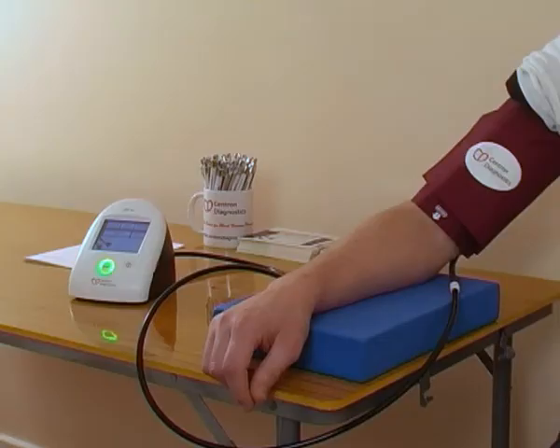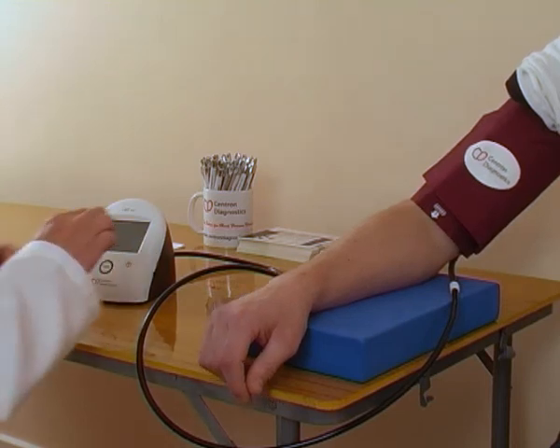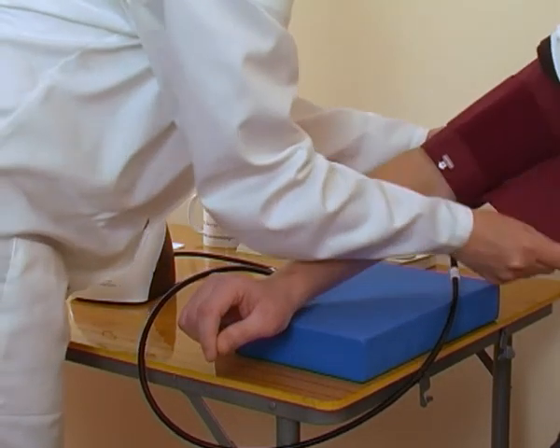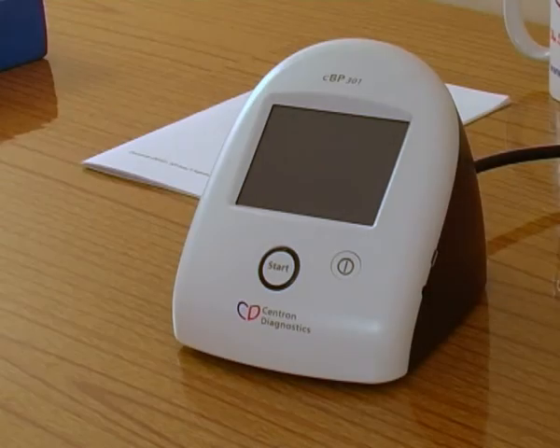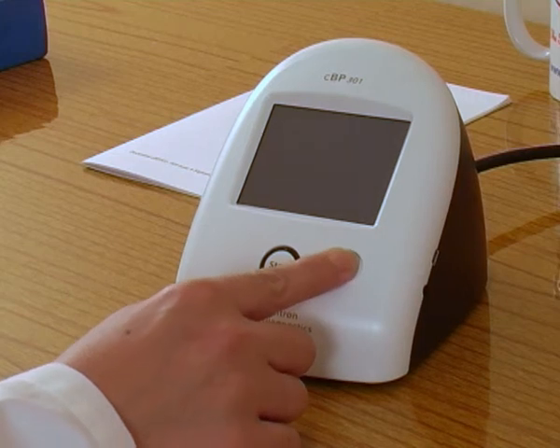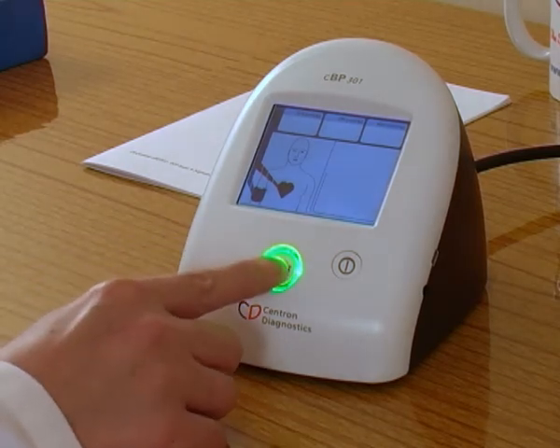After the test is complete, another measurement can be made if desired, or the unit can be turned off and the cuff removed. If the unit is turned off before the results have been recorded, they can be recovered by turning the unit on and then holding down the start button for three seconds.